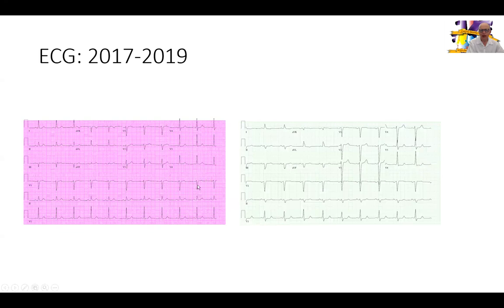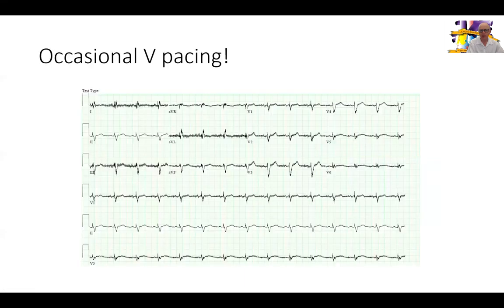This is her old EKG from 2017 on the left, and her current EKG on the right showing the left bundle branch block with an otherwise normal PR interval. Obviously she was not using her pacemaker on this EKG. However, at certain points she was getting occasional pacing — this EKG shows A-sensing and V-pacing, as nicely illustrated here.